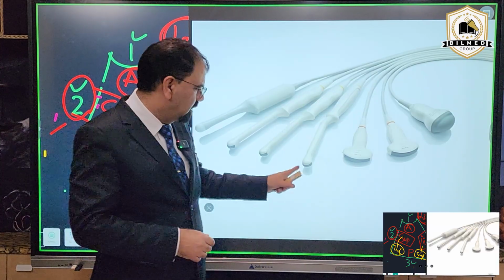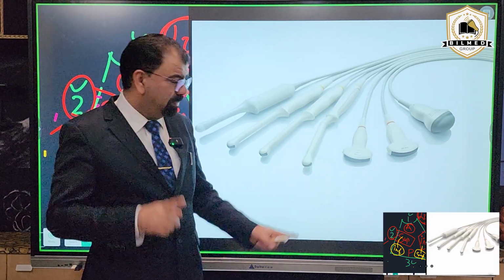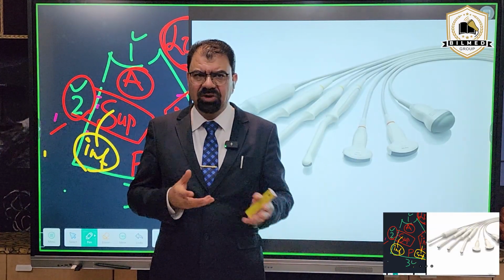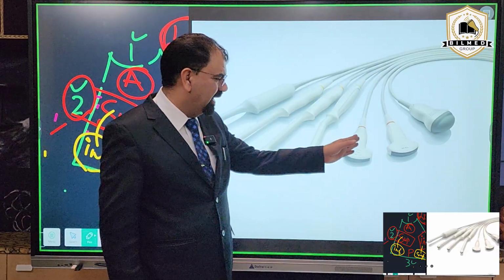Dr. Madhuri, hurry up. So, frequency. Frequency. Now, the basic difference is frequency. Let us discuss the frequency, because discussion will make you understand. Here I have high frequency, and here I have low frequency.